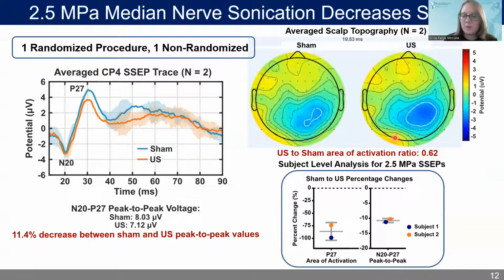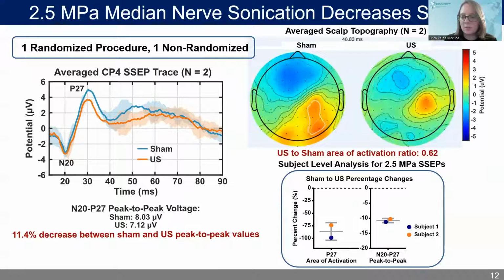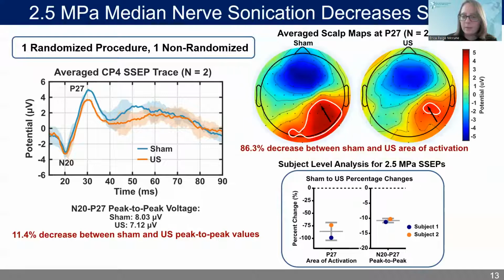In the scalp topography across time, there is a consistent activation size reduction in the FUS condition compared to the sham, with a 0.62 ratio between the two. Zooming into the P27 deflection, there is an 86.3% reduction in the area of activation between the sham and FUS conditions, and this is also greater than that which occurred at 1.6 megapascals. Finally, on a subject level, we see a consistent reduction in the overall area of activation and also the N20 to P27 amplitude.